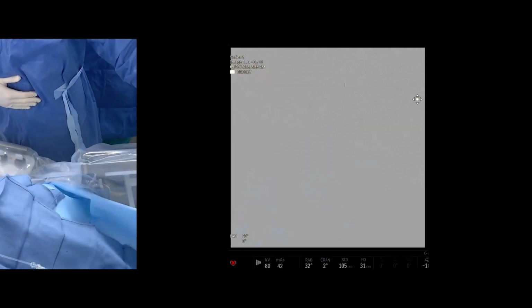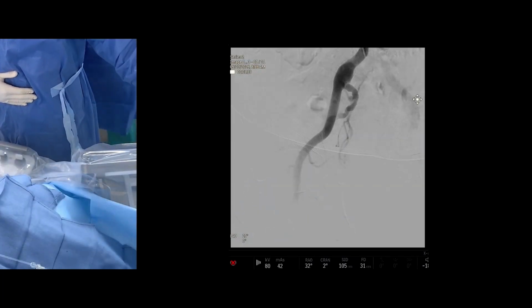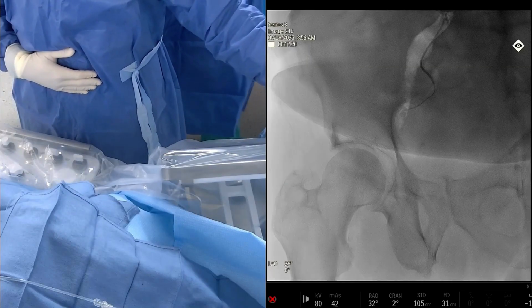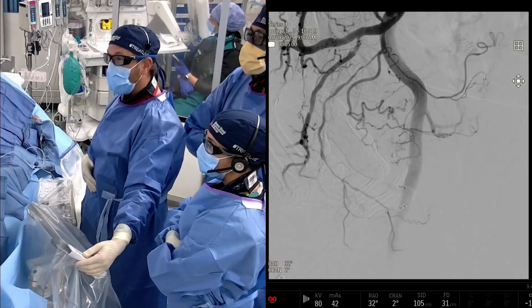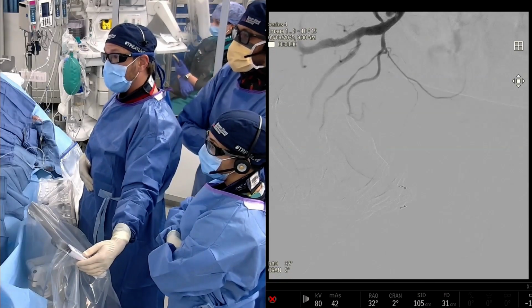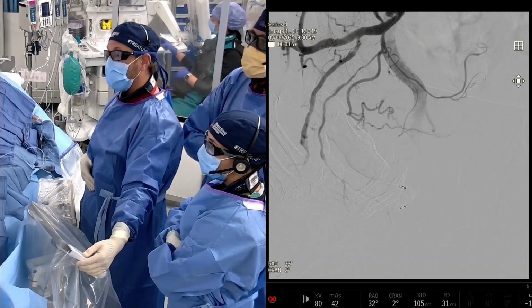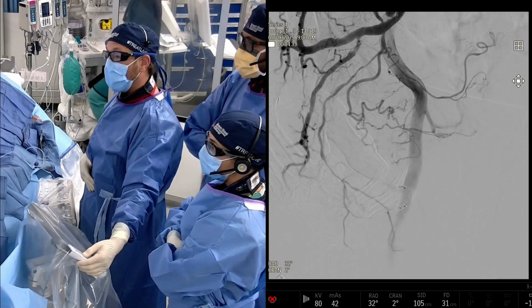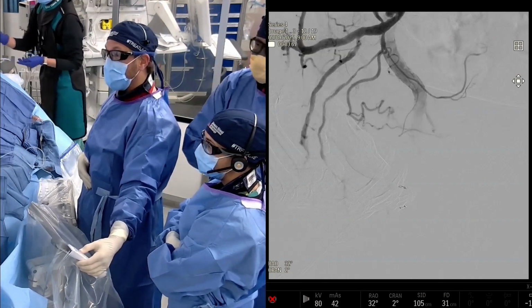All right, so we have a little bit of atherosclerotic disease at the origin of the internal iliac on that side. We used a soft glide wire, which navigated very easily into that, and then we did an angiogram. We loaded the injector with 70/30, so this was about 10 cc's of contrast. So we're just trying to keep track of how much we're using in this patient, and we see very, very clearly the prostate artery. I don't think you need a medical degree even to see this potentially.